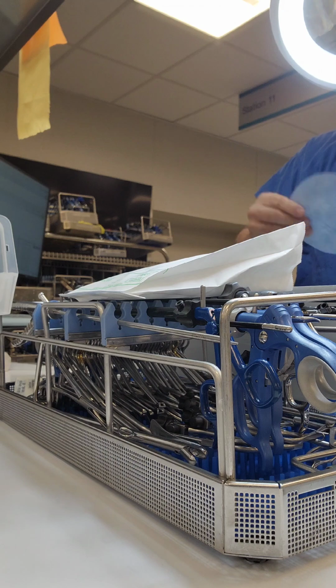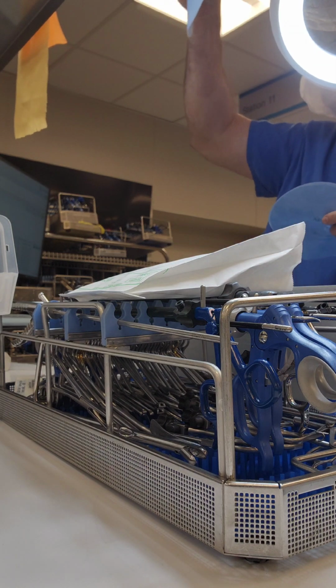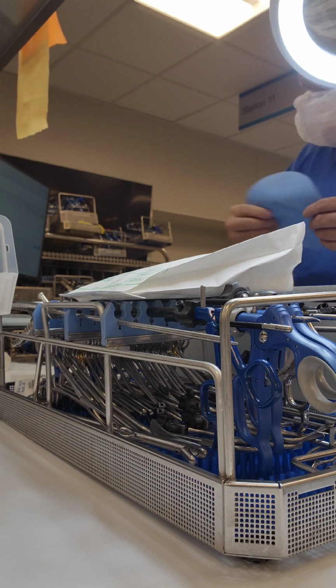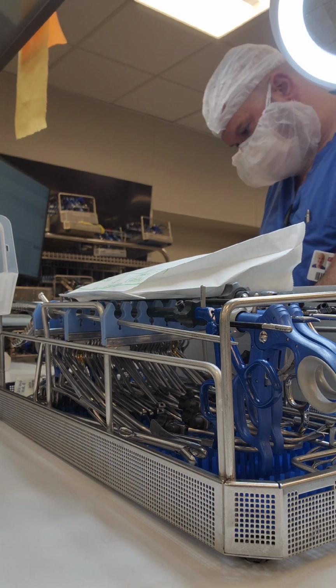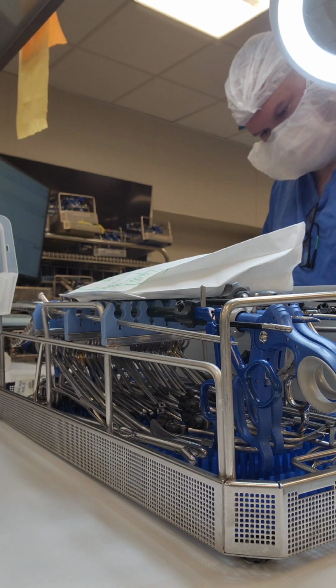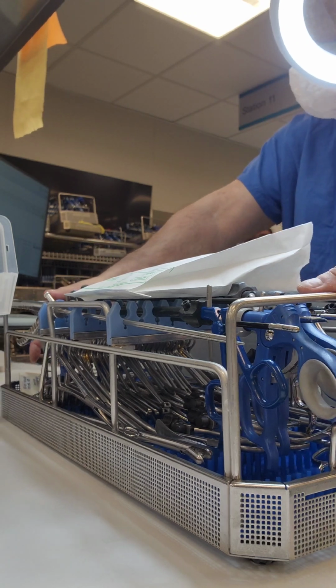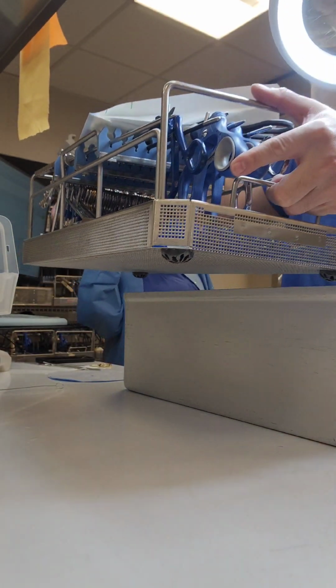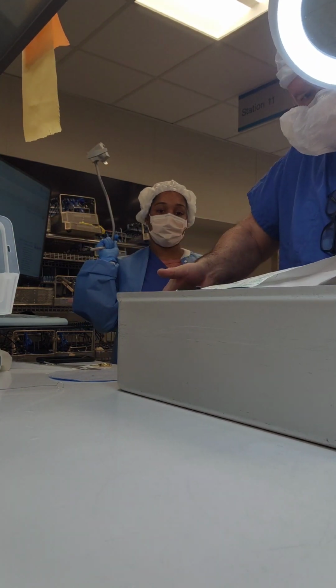So I got my filters here. Make sure that the only hole in the filter is the one in the center, right? Hold that up to the light, looking for any microscopic tears in the filters. You're gonna put that in the bottom, checking the filter retention plates. Pop them down and try your little DJ spin. They should not spin on you, right? All right, so I'm grabbing my basket here. I'm gonna go ahead and put that right there in the bottom.